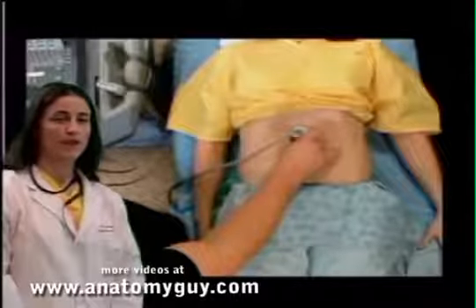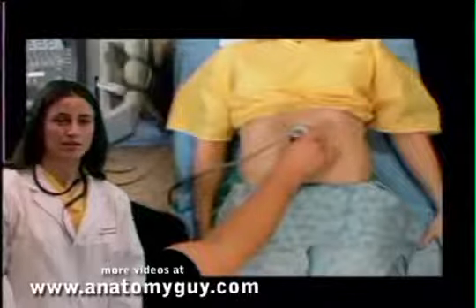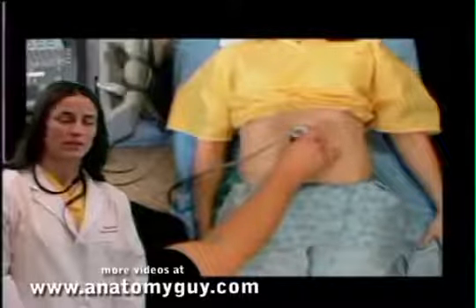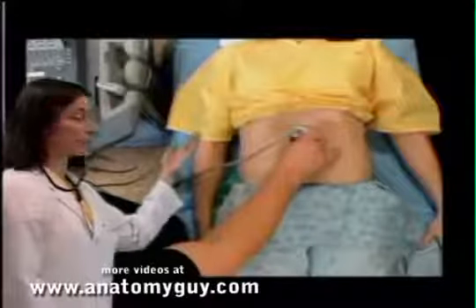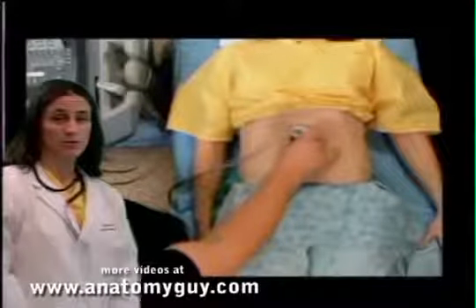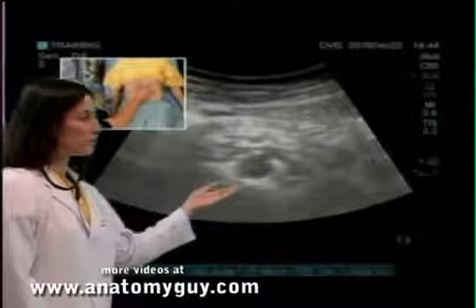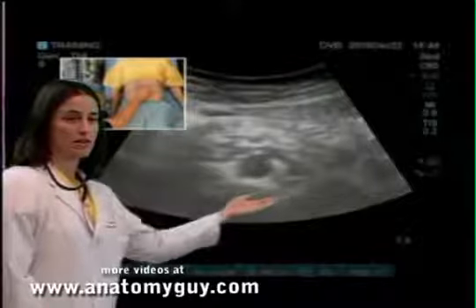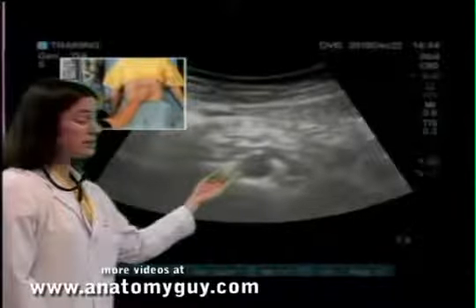After our longitudinal views of the aorta, we want to scan back up towards the patient's head. We're still left of the umbilicus, and we're going to turn our probe marker 90 degrees to get a transverse view. The probe marker here is going to be onto the patient's right side. Now we'll look at the image on our ultrasound screen. We have it frozen here. Just to orient us, down here is going to be the spine. This hypoechoic or black structure is the aorta.